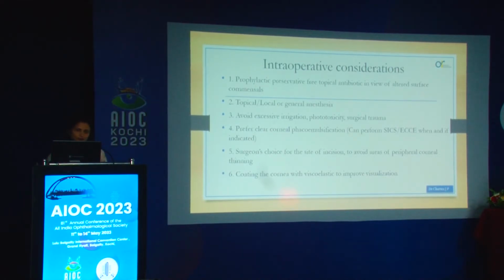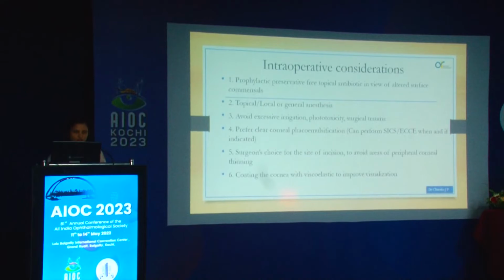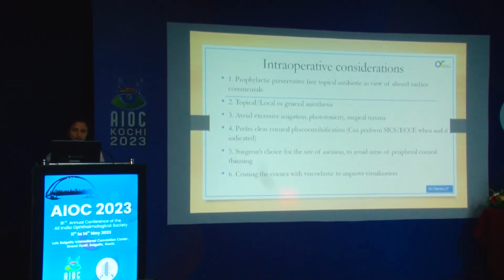It is important to inform the staff not to excessively irrigate or use excessive light because these patients are already photophobic. Prefer clear corneal phacoemulsification if it is possible, or if required, as seen, can perform SICS or ECCE.